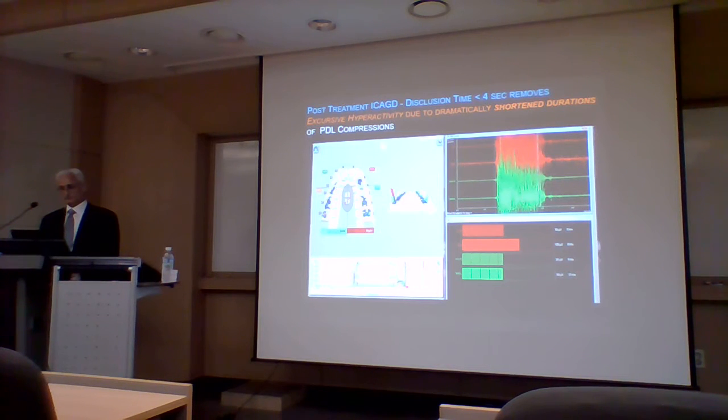그러니까 구치부 쪽에서 가이드되는 것들이 없어지고 전치부에서 가이드가 분명하게 역할하는 걸 보여주고 있고, EMG를 보면 And then in the EMG, she bites down, holds her teeth together, moves to the right, and you see the muscle activity is almost gone.